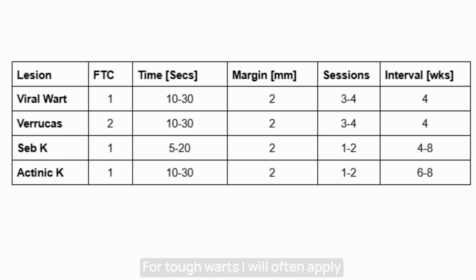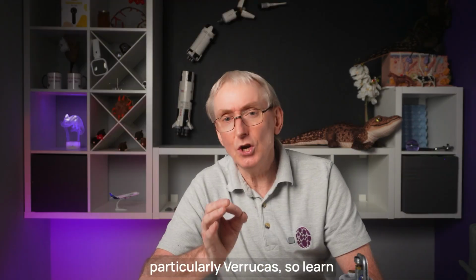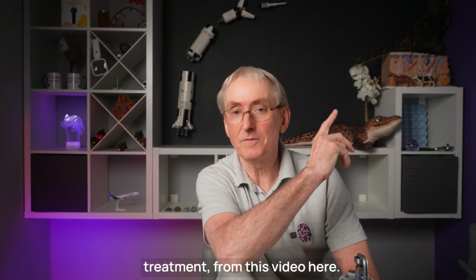For tough warts, I will often apply 2 30-second freezes with a full thaw of the lesion in between. Sometimes 1 session will do the job. Warts can be much more resistant, particularly verrucas, so learn more about warts and their treatment from this video here.